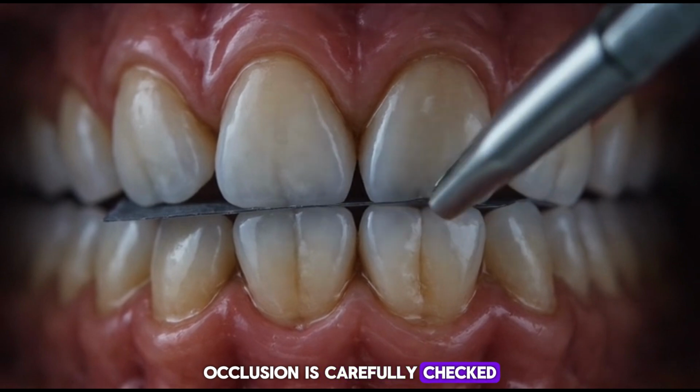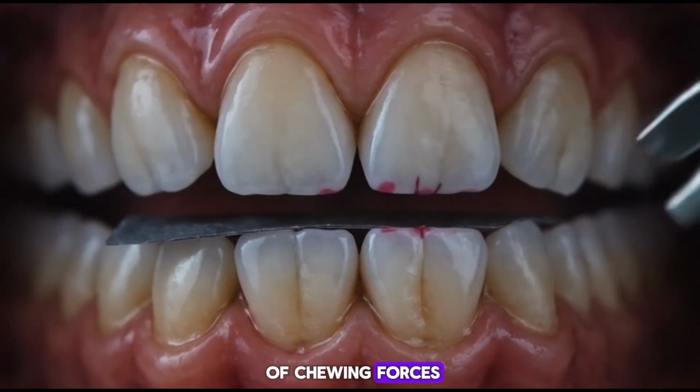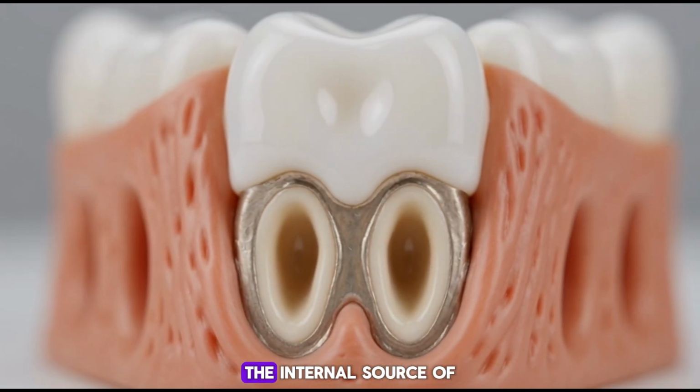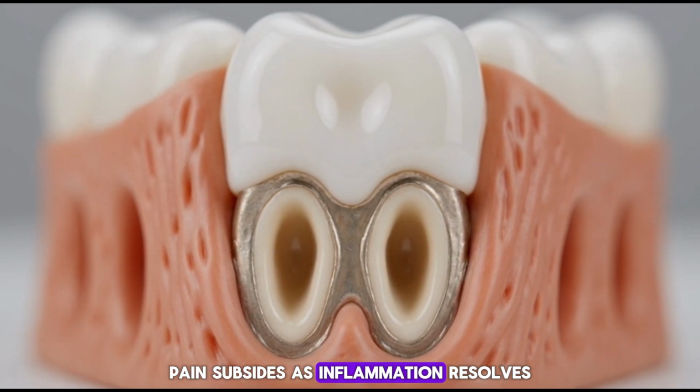Occlusion is carefully checked to ensure balanced contact during biting. Even distribution of chewing forces protects the underlying root and surrounding bone. Immediately after treatment, the internal source of pressure is eliminated. Pain subsides as inflammation resolves.